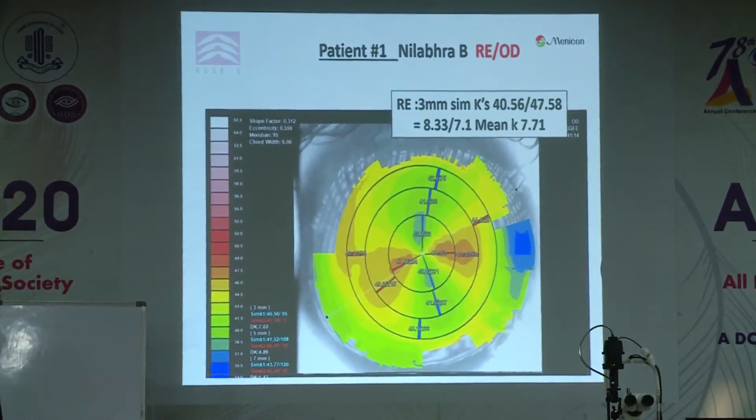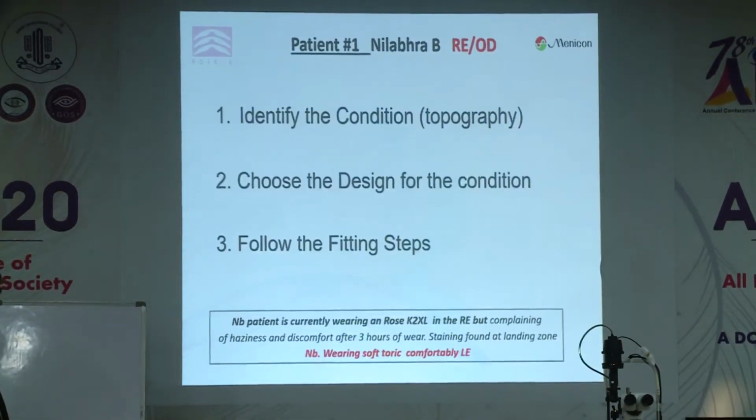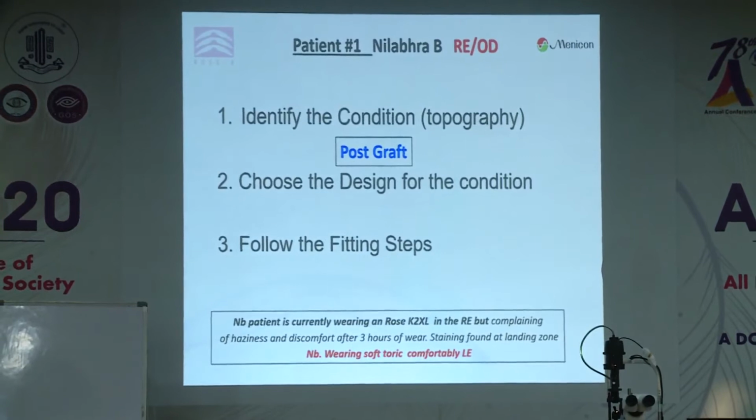So this was his topography, and very typical of a graft. There's no regular pattern. You can get all sorts of shapes on a graft. But the big thing to notice is that the mean K is 7.71. So we have a graft.